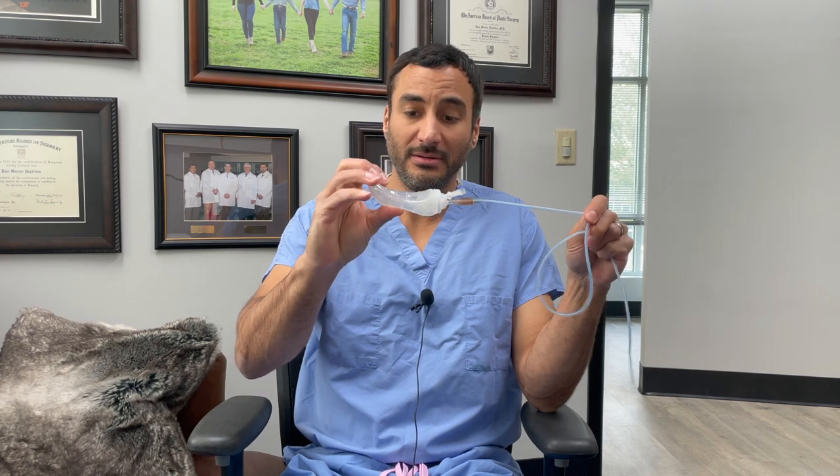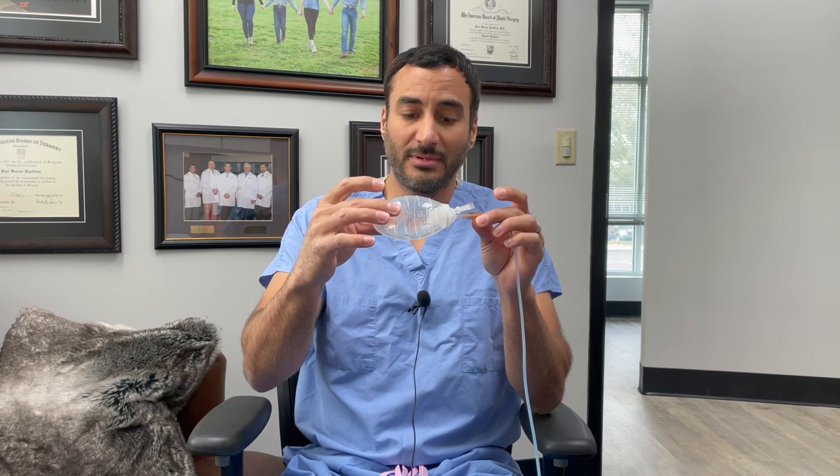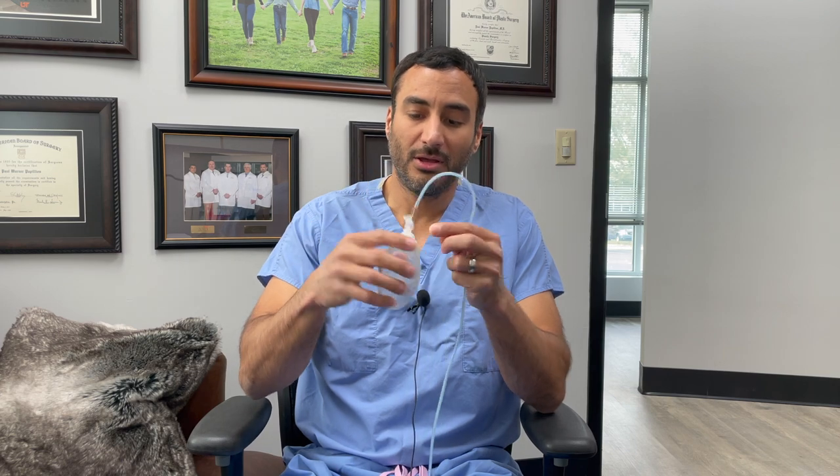When it's charged, it'll look like this — it'll be compressed fully and on suction. When the bulb fills up over time with fluid or liquid, it'll slowly get larger and larger. Whenever you're emptying and recording how much is coming out, you will uncap the bulb, set it as full, and you'll look at the measurements.